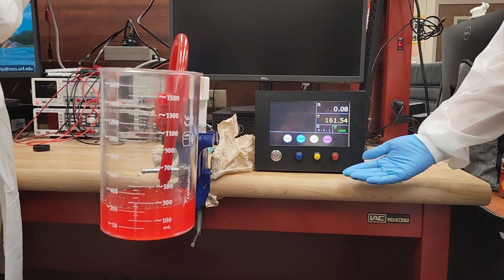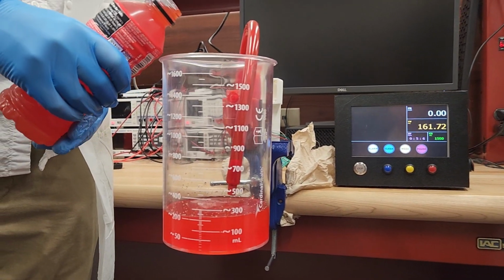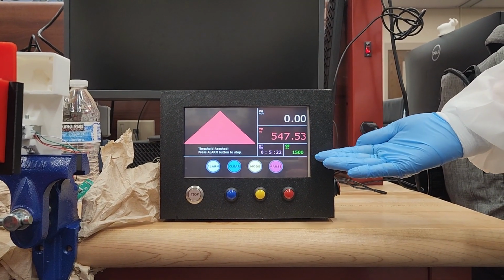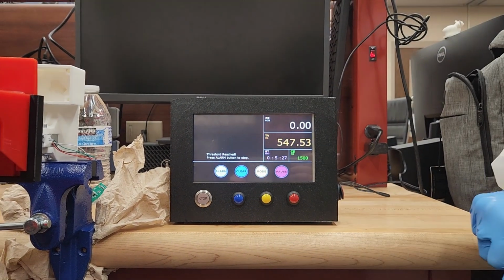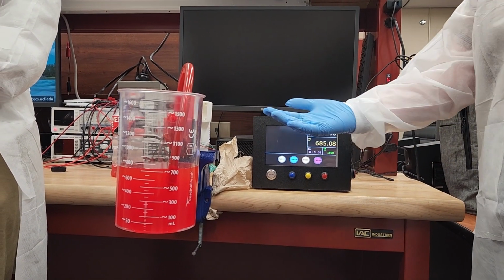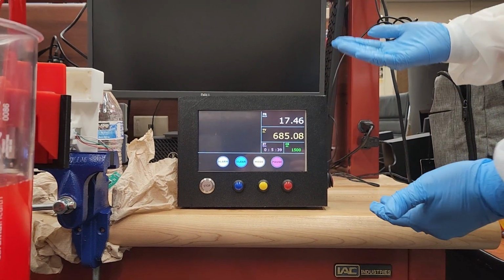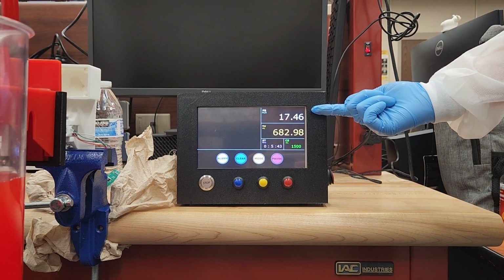Next, we will demonstrate meeting the 500 milliliter threshold. Here you can see that we have exceeded the 500 milliliters and triggered the alarm, which I will disable now. Tracking has continued. We could add additional fluid to meet the threshold, and that is the threshold met for our blood flow, which is displayed up here.